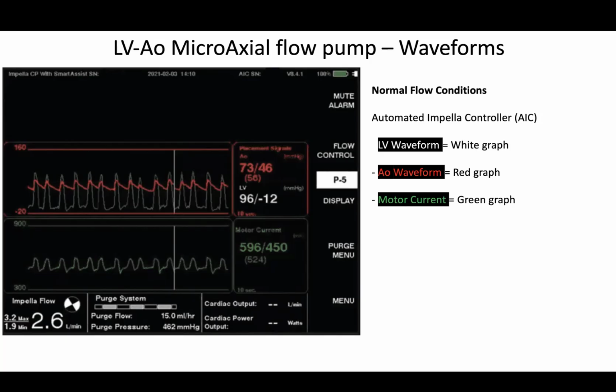So it's fluid that comes out right before the actual outlet to prevent clotting of the impeller. That's all it does, but it's very important because if you have any issues with this, it clots relatively quickly. I saw a couple in fellowship that got clotted, and it's pretty bad.